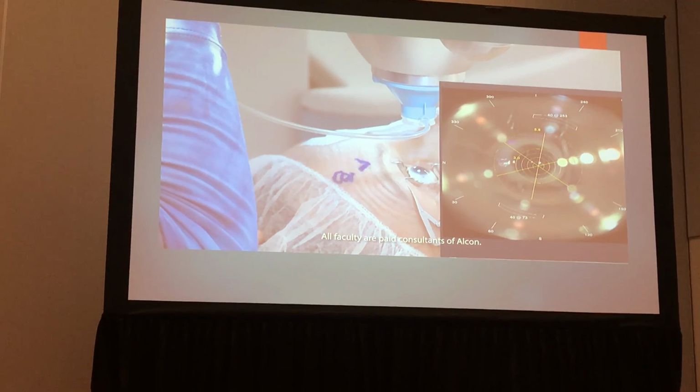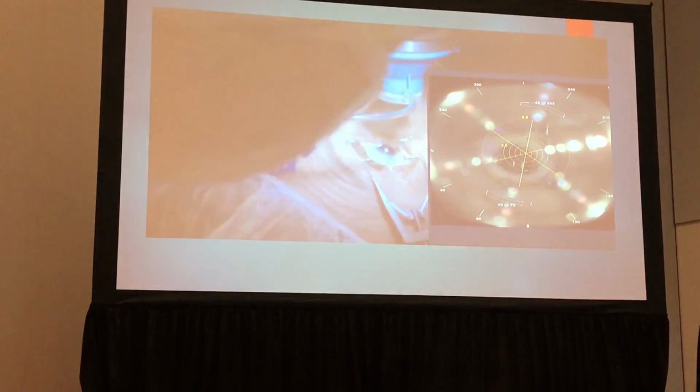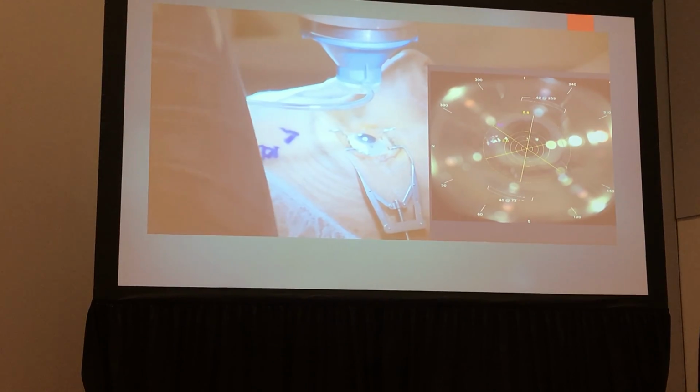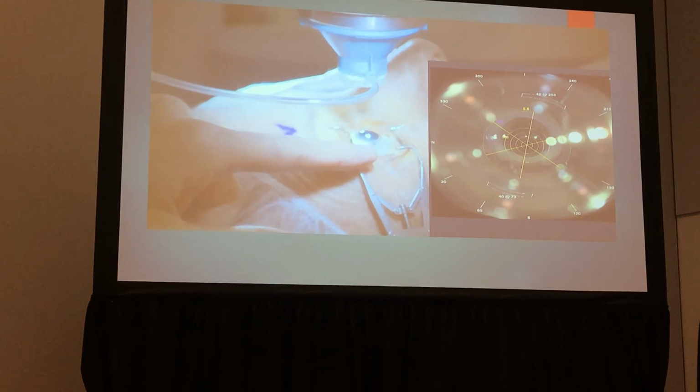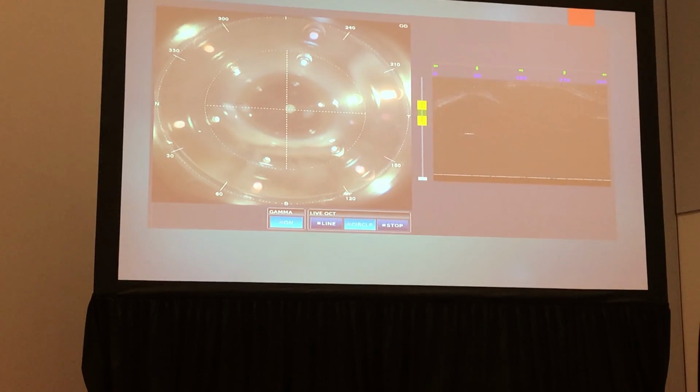There's going to be a ring of lights. That would be perfect. Can I have lights off in the room, please? So I'm going to need you to bring your chin up just a little bit, okay? And you'll see that ring of lights right there. Just keep looking toward that ring of lights. We can go ahead and dock the patient at this point. Let's go back down. Keep looking at that ring of lights.